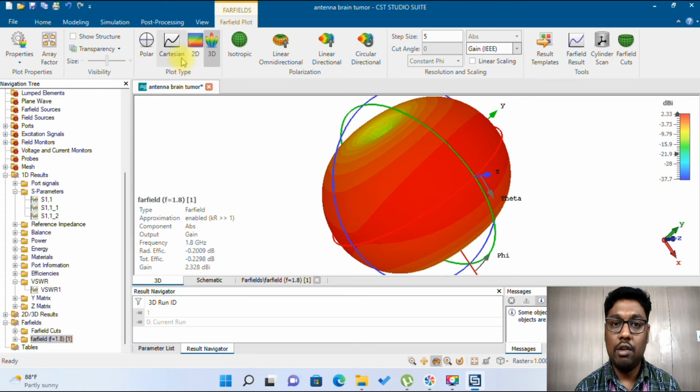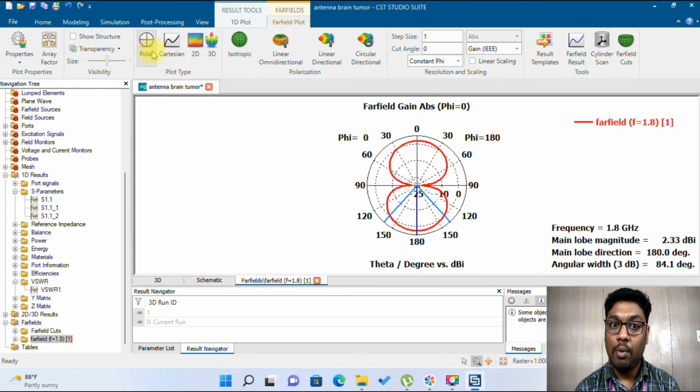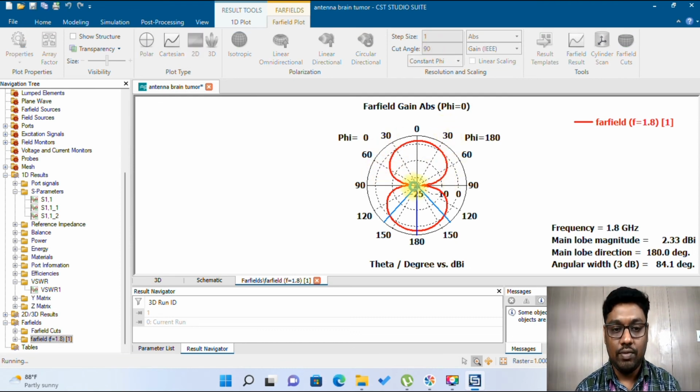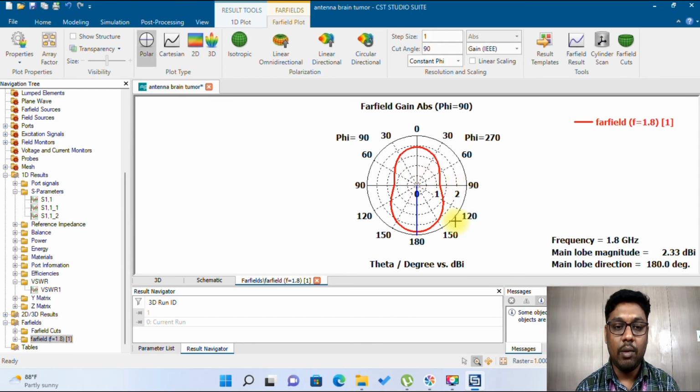And if you want to create a polar kind of chart for E field and H field, you can generate the E field radiation pattern and H field radiation pattern. So the option is, here you have an option called phi cut angle. If you put it as 0, that is the E field radiation pattern, and if you give it as 90 degrees, it will produce the H field radiation pattern. So by giving the value of phi, you can generate. So this is phi equal to 90, which is basically your H field radiation pattern.